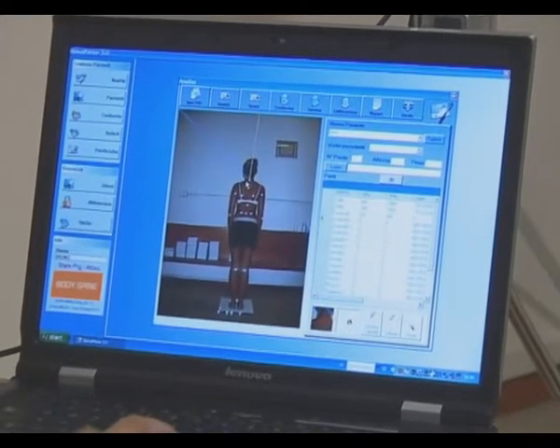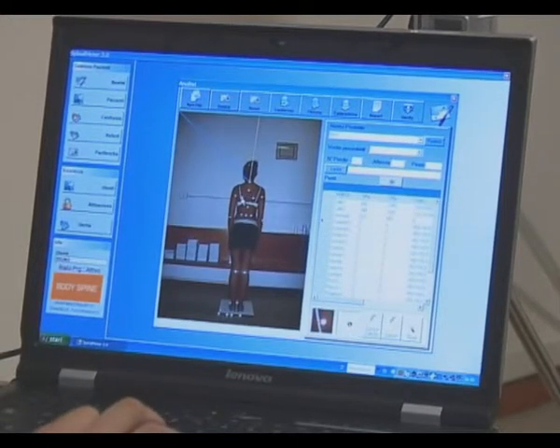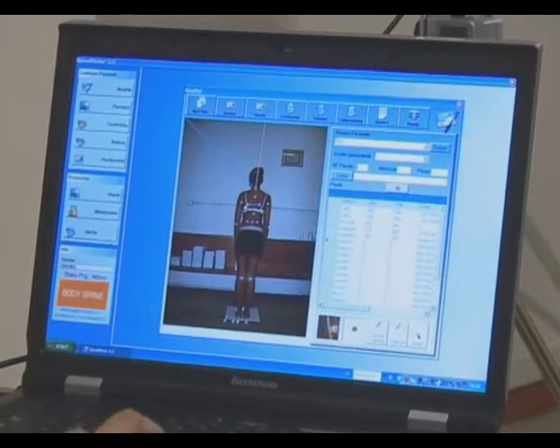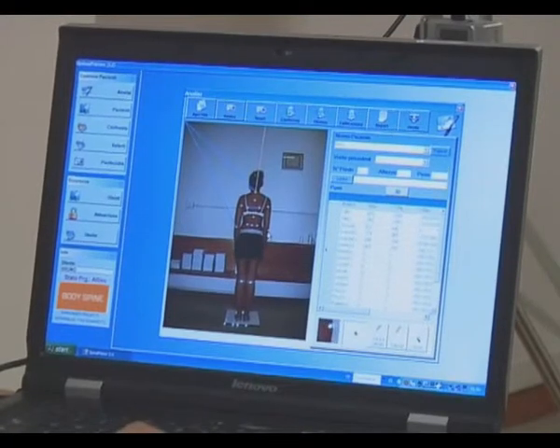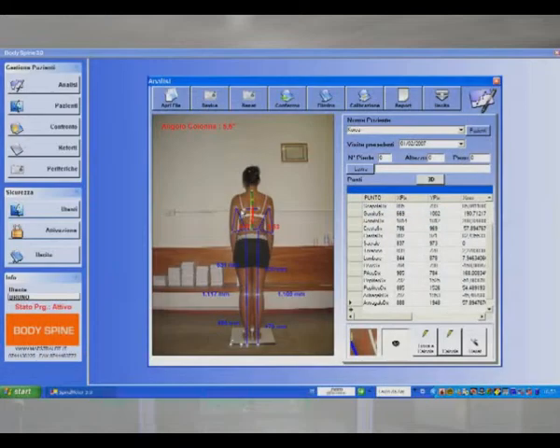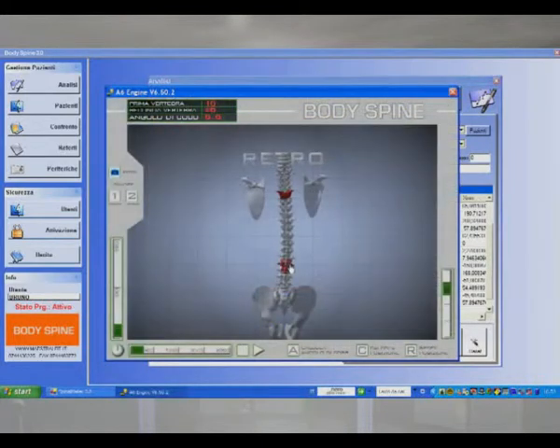3D Bodyspine is able to automatically measure the length of the upper and lower limbs and calculate data that is presently done manually, such as the Cobb's angle and backbone curve. A true and proper revolution in this field. The patient will now have all the values available that, once processed, are presented as numeric data and can be converted into a three-dimensional representation.